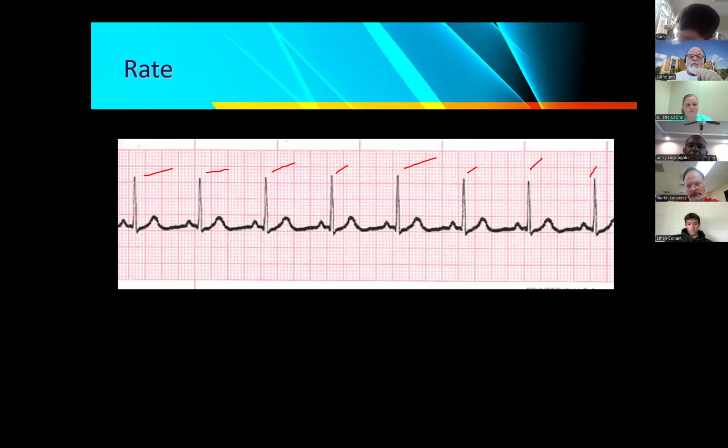Okay. Now, Sam, I'm going to stay with you, and that's what I'm going to do. I'm going to try to get as many of you all through this. Okay. So the rate is 80. Normal or abnormal rate? Normal. Perfect. Very, very good. Okay. Now, let me ask you a question. Do you see P waves? Yes. Do they look normal?